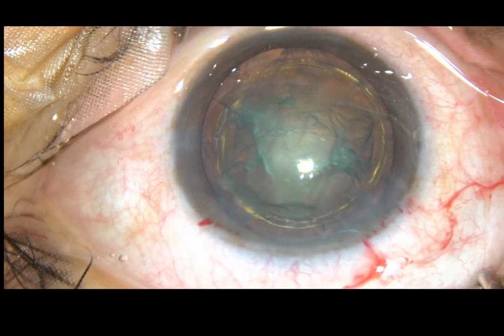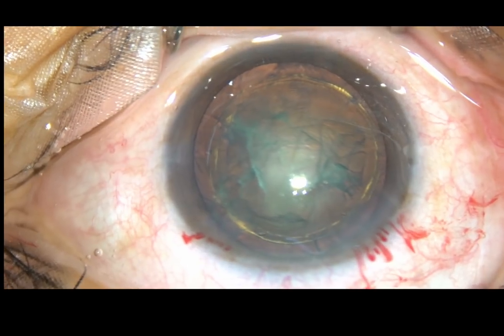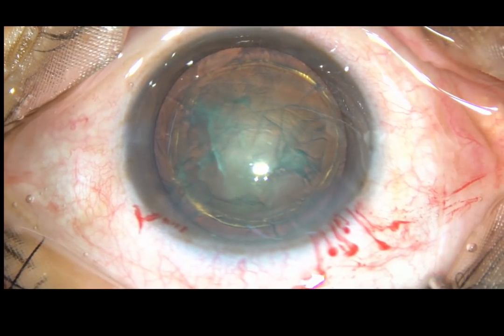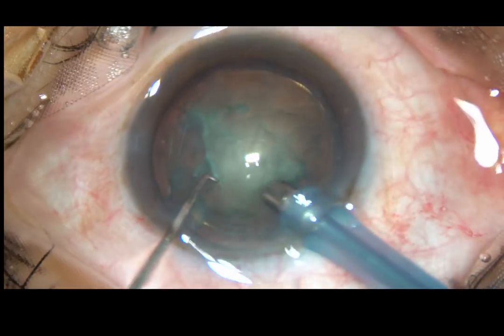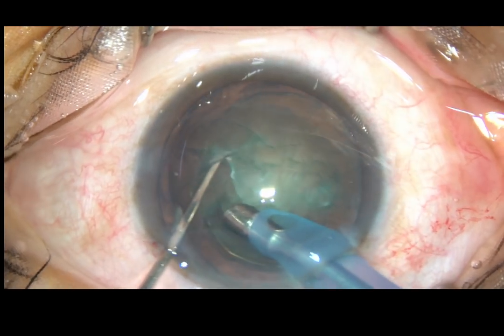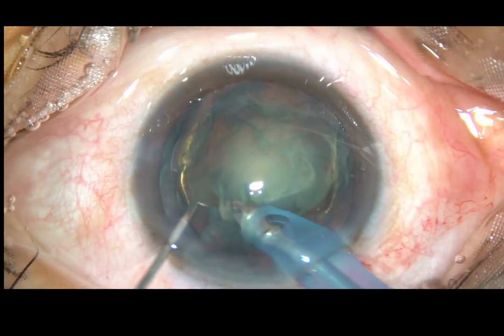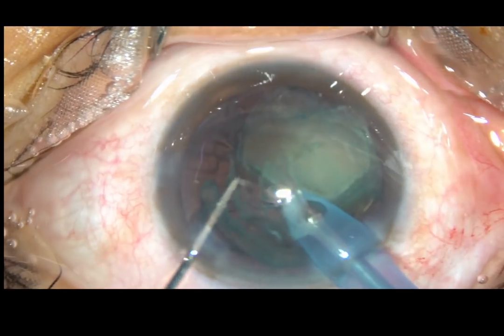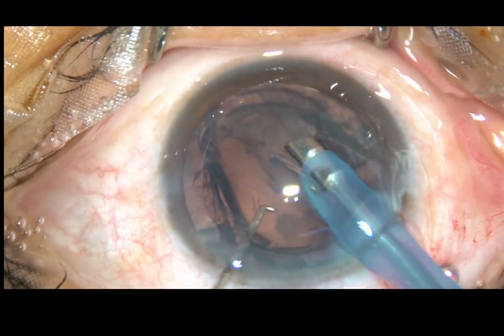The nucleus should rotate very nicely and very freely. Unless it is rotating nicely, please do not attempt this technique. Now, the tip of the FACO handpiece is introduced into the anterior chamber and placed at the margin of the nucleus. As the foot pedal is pressed, the nucleus rotates and in no time it gets emulsified and removed.